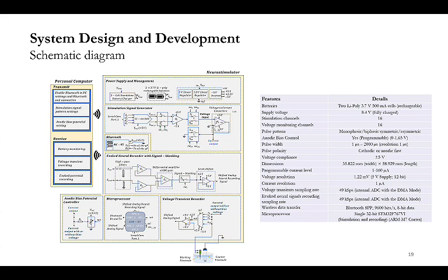With all the sketching and theoretical knowledge, we started with schematic design. I used Altium Designer PCB software, designed the schematic and created all the component libraries. After that, you see the final PCB layout here. Each color represents each layer. Basically, it has 6 signal layers and 4 power planes, to make the whole system as compact as possible using discrete electronic components.